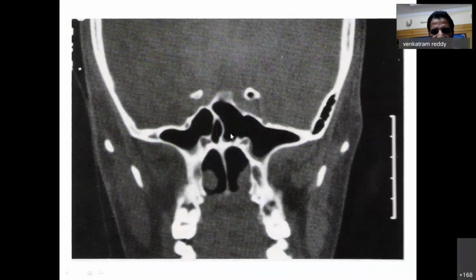Then again, this is a very far lateral pneumatization of the sphenoid, going beyond the lesser wing and greater wing of the sphenoid. If you have any pathology, you need to tackle it with an angled telescope from here, and this angulation needs angular instruments, and you need a lot of endoscopic expertise to tackle any pathology very laterally.